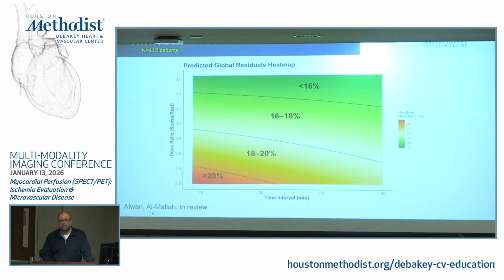So our residual dose is going to be much lower, less than the desired 20%. So we felt that this is a better way of doing this. Anyway, I'm reducing the dose, so that's good for the patient, and I'm also not blocking the table for a long time. So this is the protocol we are using here.